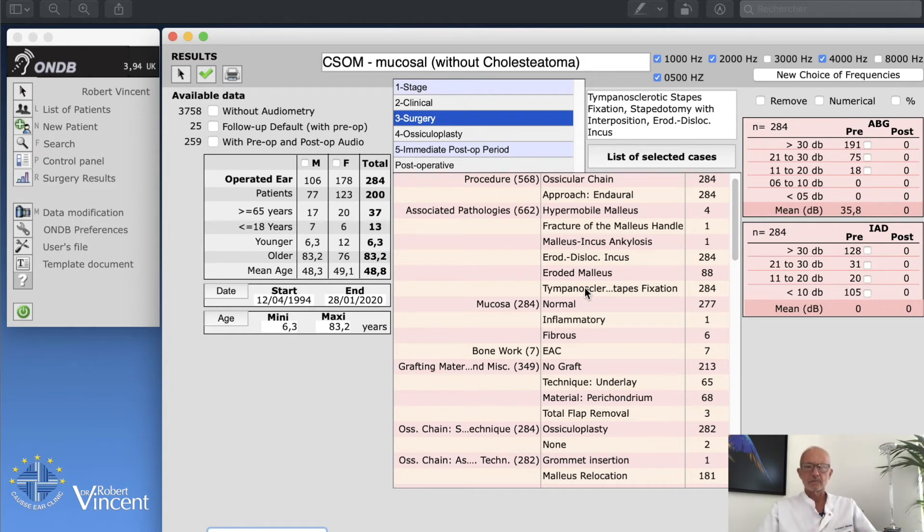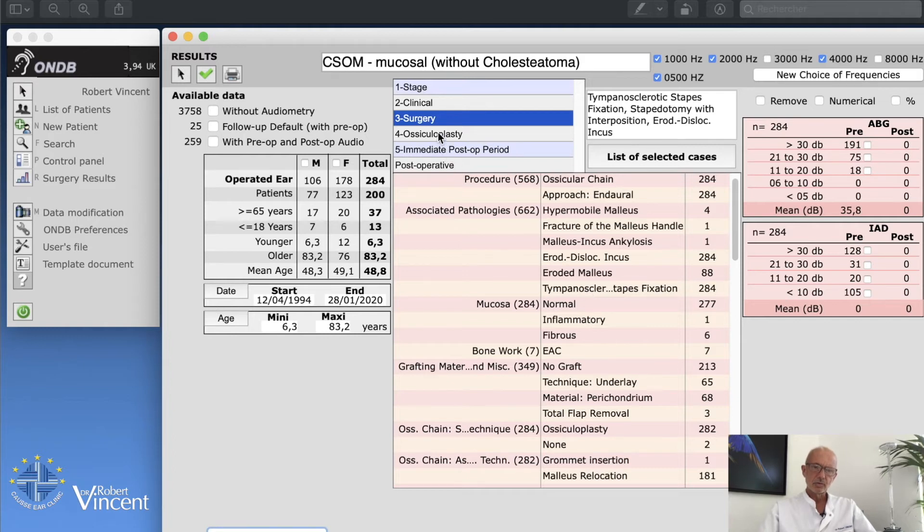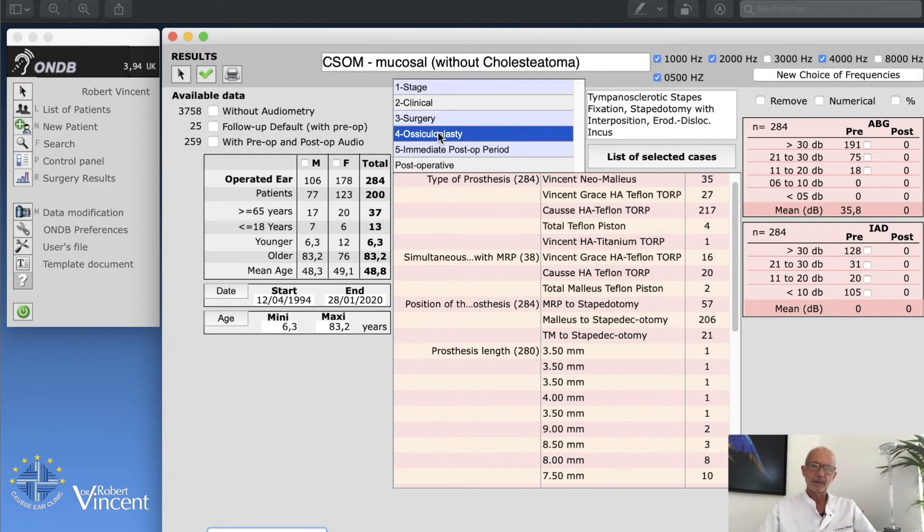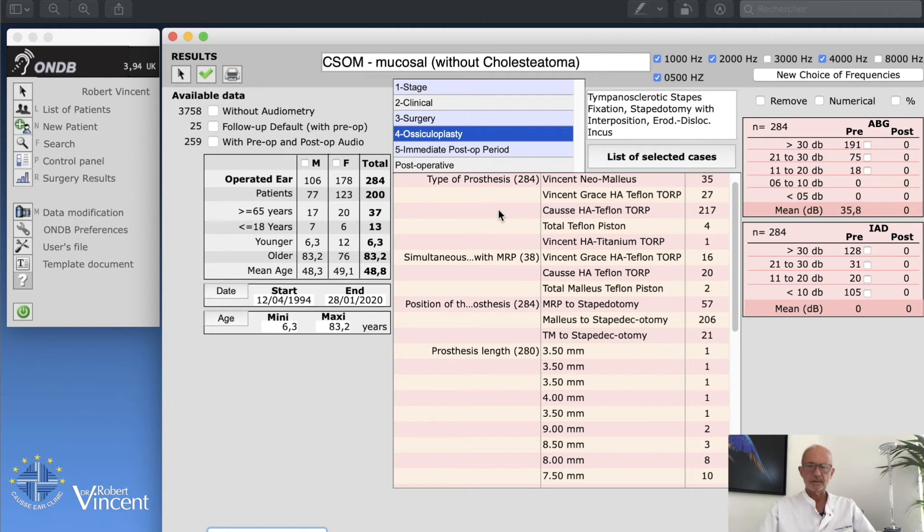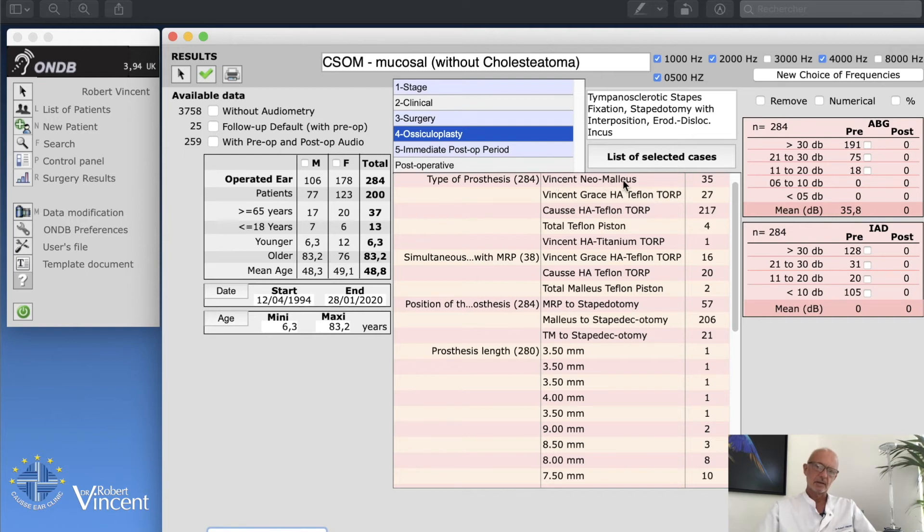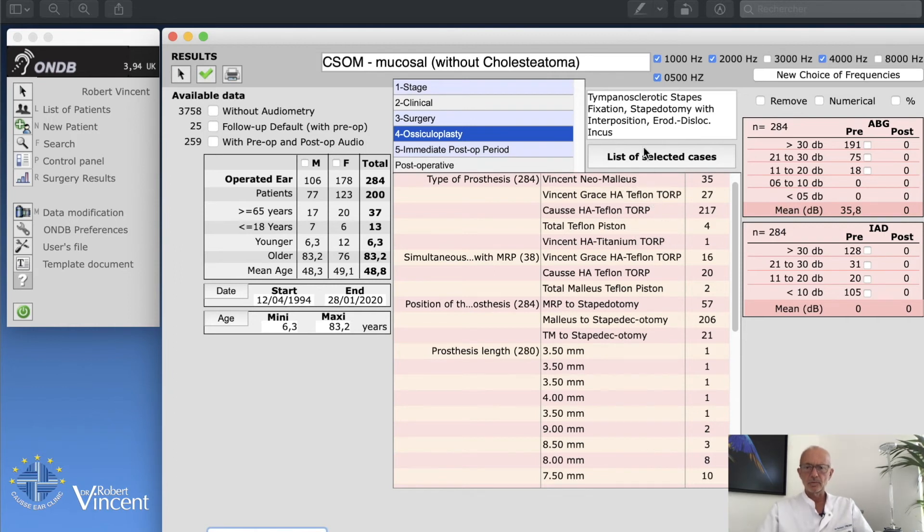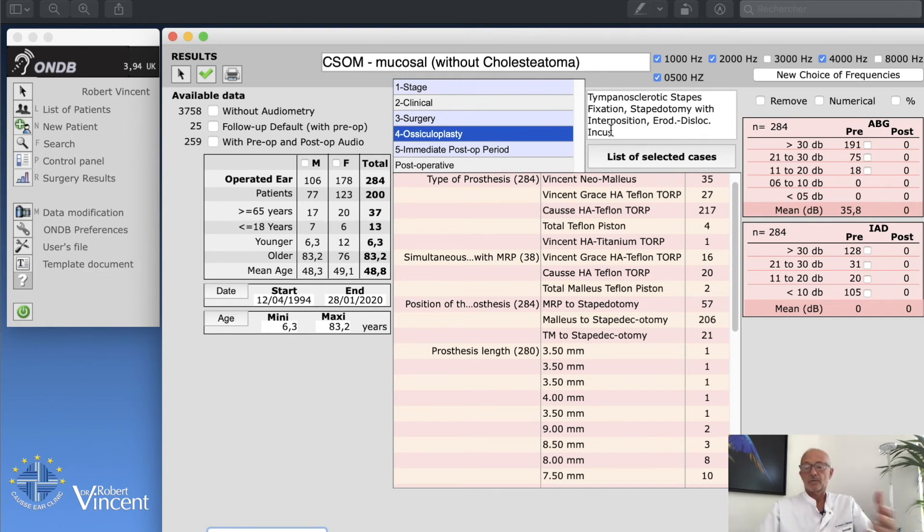There's a lot of different things, sometimes we use different types of prosthesis. So I will go to ossiculoplasty and then just study what we have. We have the type of prosthesis. We have the Vincent neo-malleus, which is the malleus replacement prosthesis, but these are the TORP which were used in this case because I remind you, we have tympanosclerotic stapes fixation, stapedotomy with eroded incus.